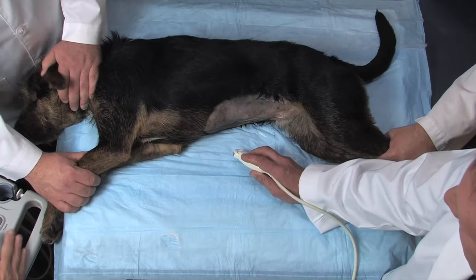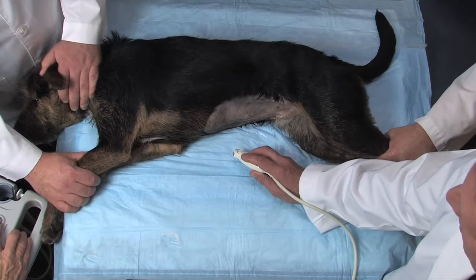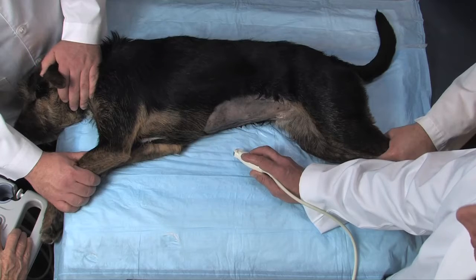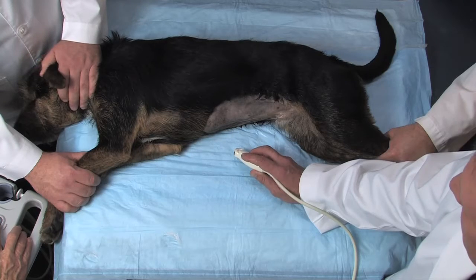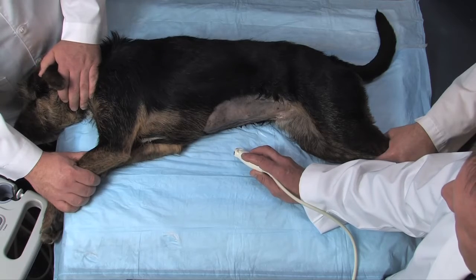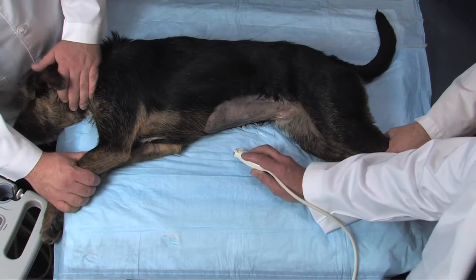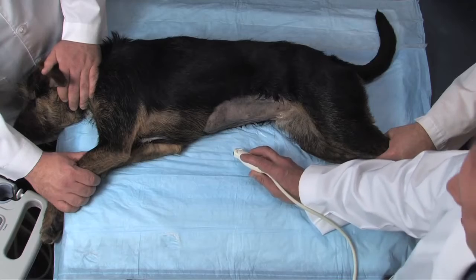Notice this dog is shaved just to better show you landmarks. However, in most cases shaving is unnecessary for adequate imaging during AFAST exams.